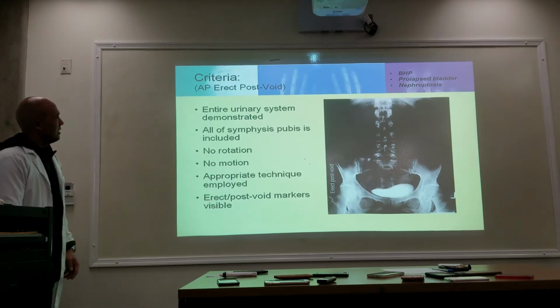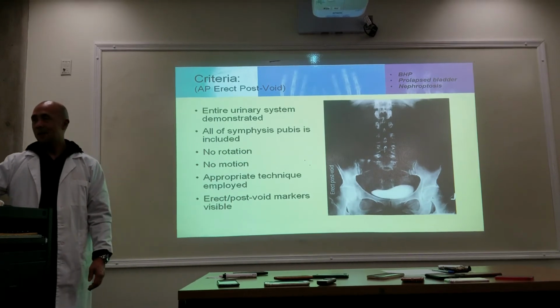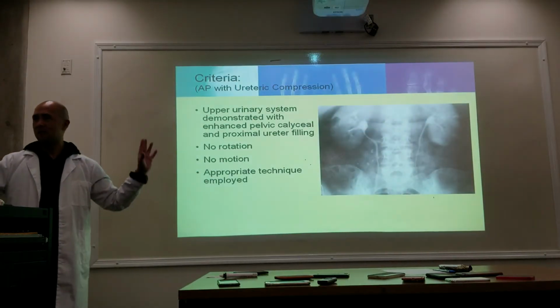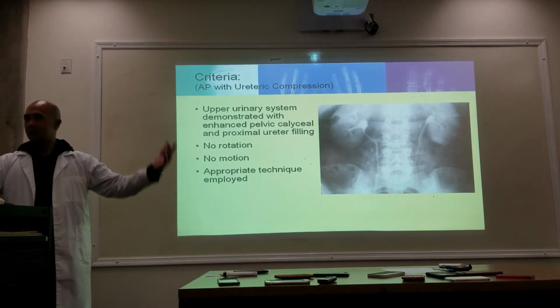All right. So upright, looking at the bladder. Okay. I'm just gonna have you guys look through this on your own. We've already talked about this. There's no need for me to talk about this anymore. So the compression paddle keeps the contrast up in the kidneys, right? Okay.